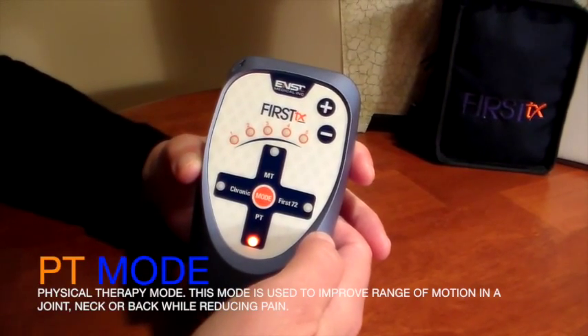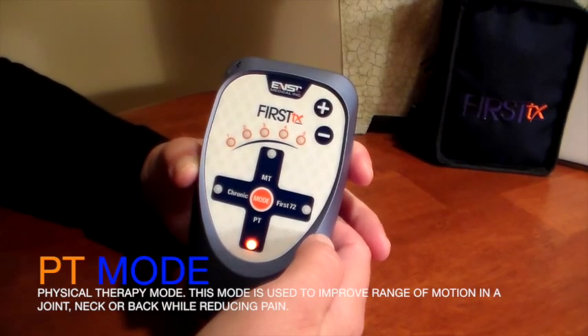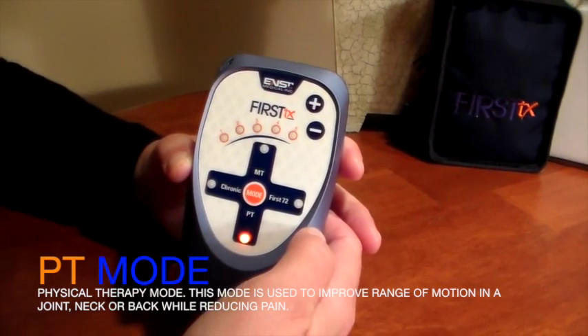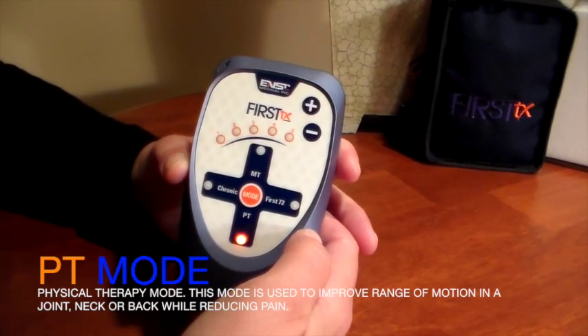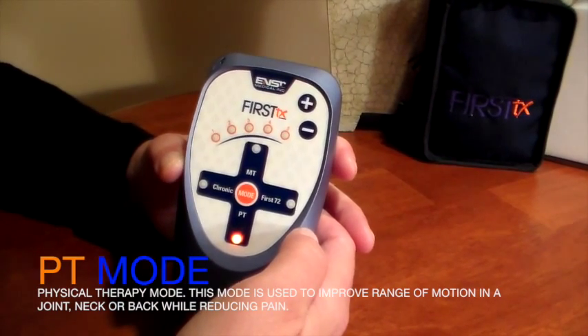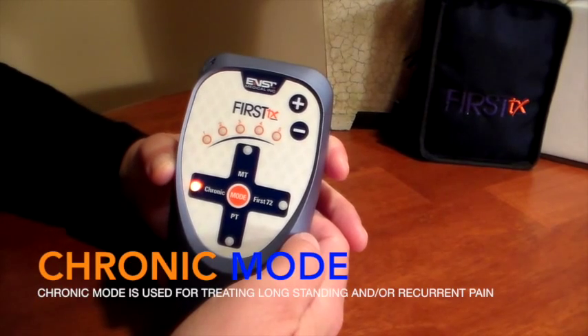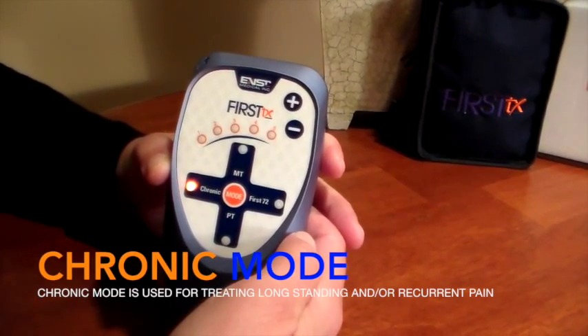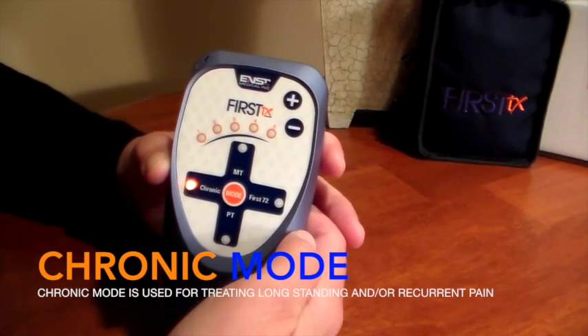PT stands for Physical Therapy. This mode is used to improve range of motion in a joint, in the neck or in the back, while reducing pain. Finally, chronic mode is used for treating areas of long-standing and/or recurrent pain.